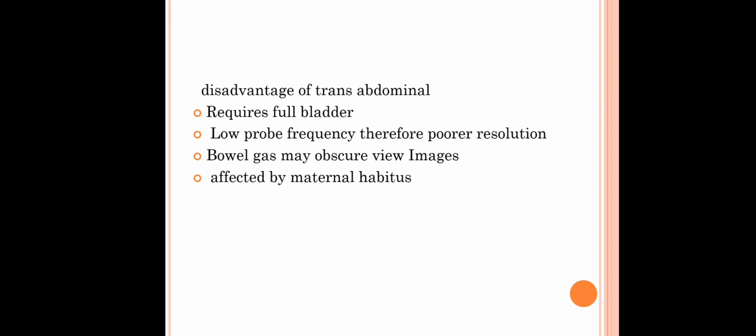However, the disadvantages: it needs a full bladder, the frequency is low, so the resolution is less than transvaginal, and bowel gas, if present, may obscure the image.